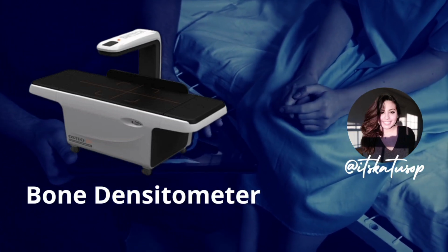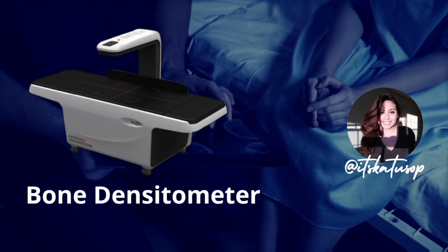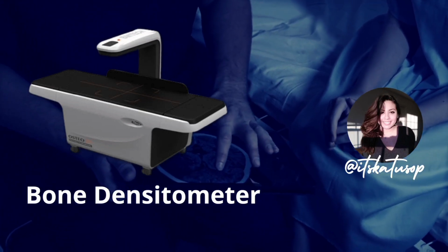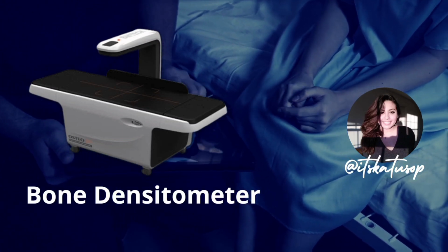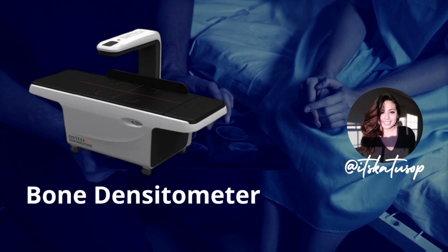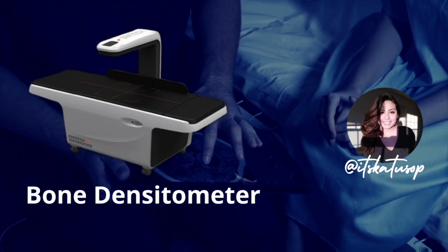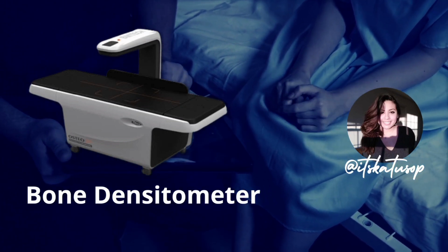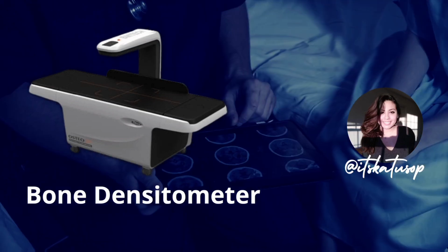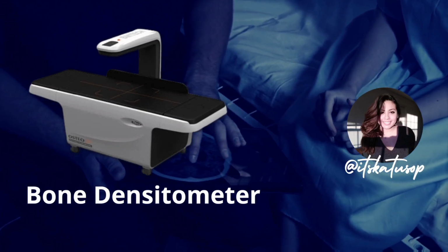density. During the scan, the patient lies on a table and the scanner moves over the area of the body that is being scanned. Usually, the part that is being scanned is the spine, the hip, or the wrist. The scan takes a few minutes and it's pretty much painless. The results are usually available right away, and the patient can leave the clinic right after the test.